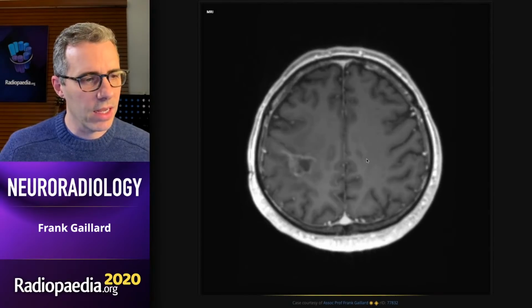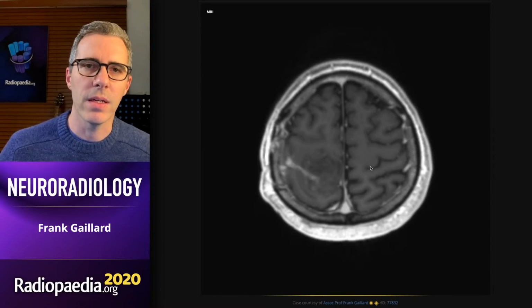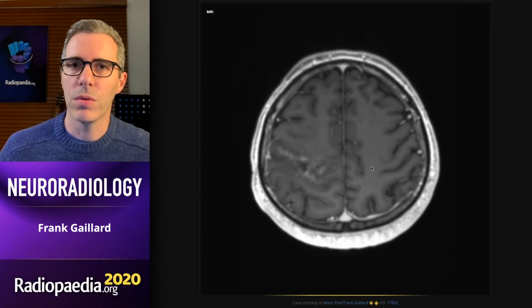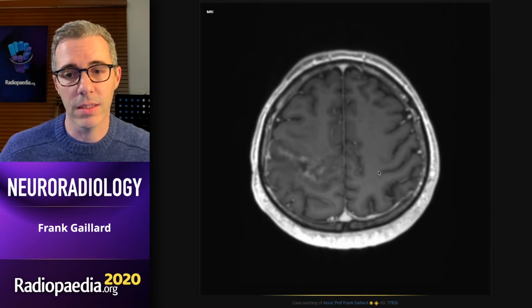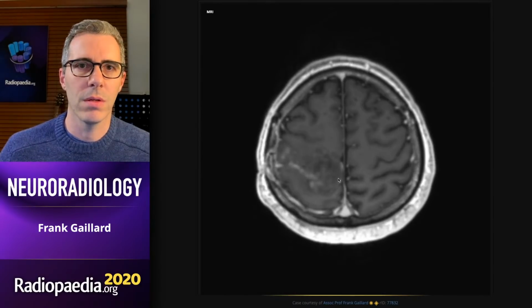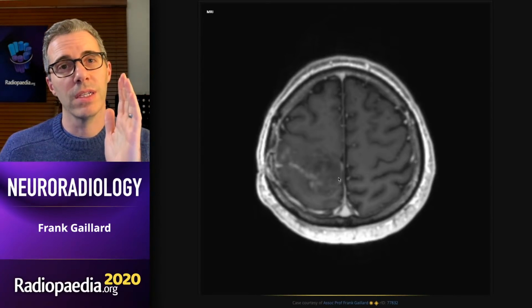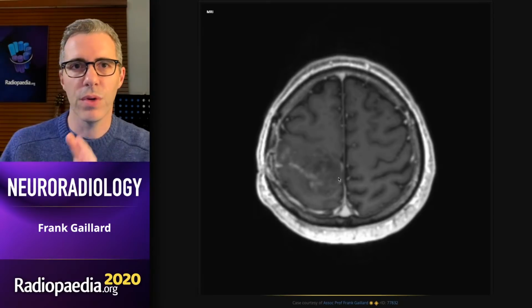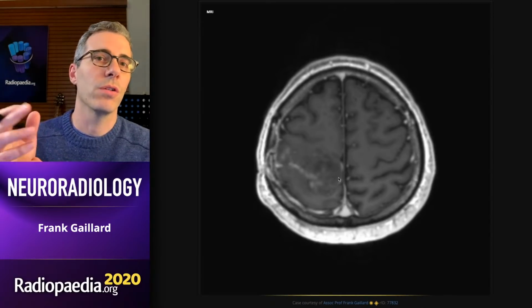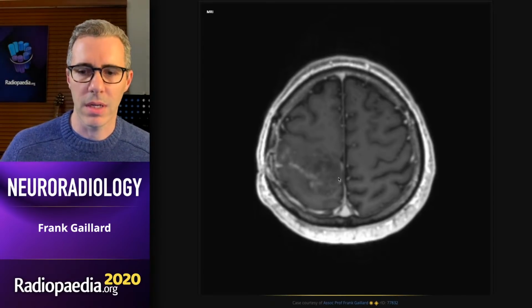But when you go to post-contrast scanning, come to the top, it's sort of underwhelming. There's less enhancement here than there was around the resection cavity before. So if you're just focusing your attention on contrast enhancement, you would call this response. But in fact, not only is this pseudo response, down here you've actually got progression. So here we've got a patient who started off with a GBM, went on to get treatment effect or pseudo progression with some tumor progression. That grew, he was changed to Avastin and got pseudo response, but continued progression at the same time. So all these effects can happen concurrently.